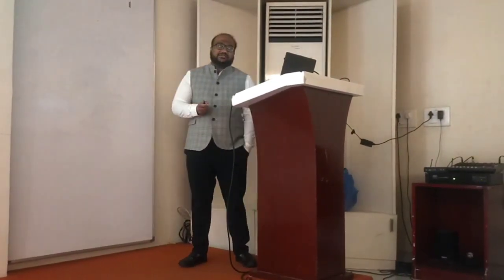This is the lateral view. This is how your lumbar vertebra looks in a lateral view. The one added thing here is this is your intervertebral foramen. So this is where all your spinal roots exit.